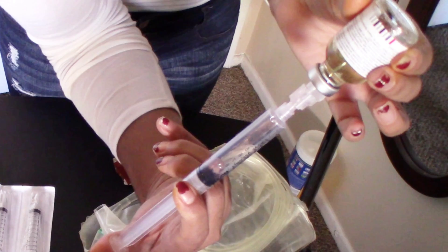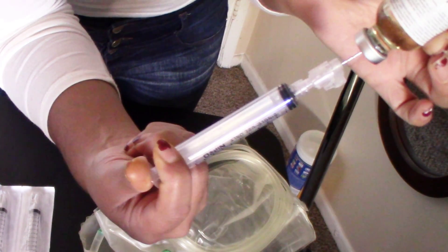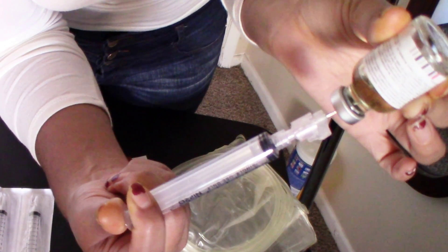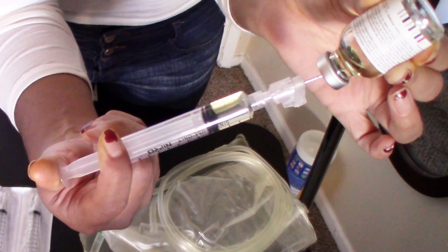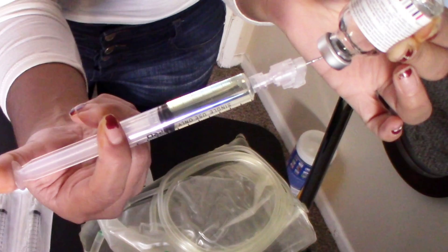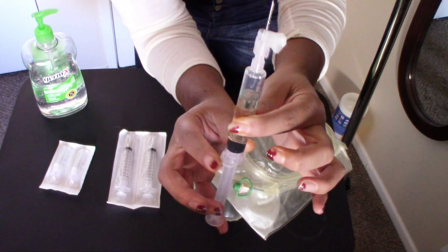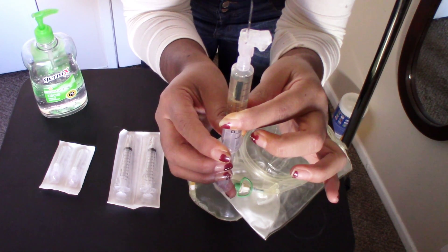We're going to flip the syringe and push the air back into the vial. Now this is where you have to act fast because there is a lot of pressure inside the vial, so try to pull the needle all the way to the end of the vial and tilt it to the side. Now release your thumb — there will be some air in your needle, so slowly push the air out.